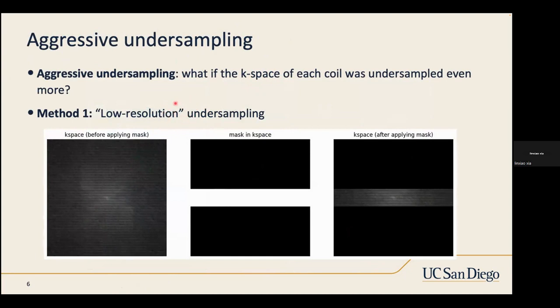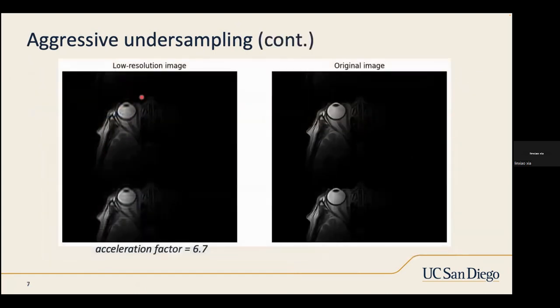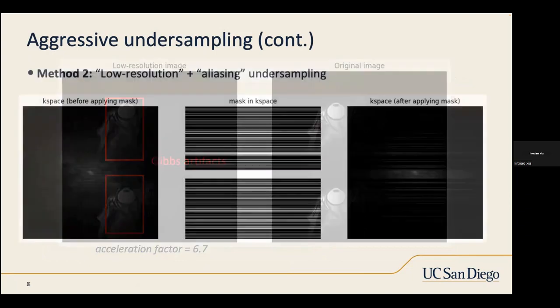As you can see, the ideal binary mask in the middle mostly samples the low frequency region. There are two consequences. Firstly, without high frequencies, the image will lose a lot of details and sharpness. Secondly, since the filter is ideal, it will lead to Gibbs ringing artifacts, which will still be there after SENSE reconstruction. We will use deep learning to see if we can eliminate those artifacts.